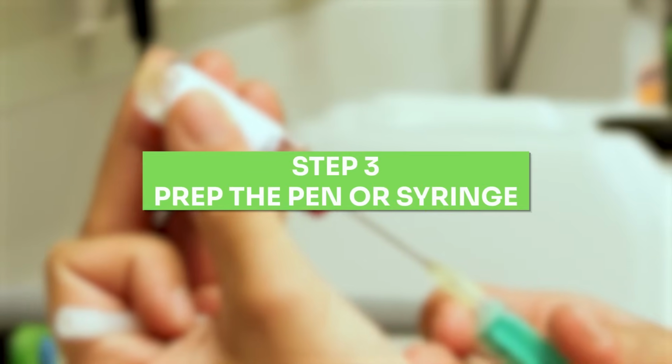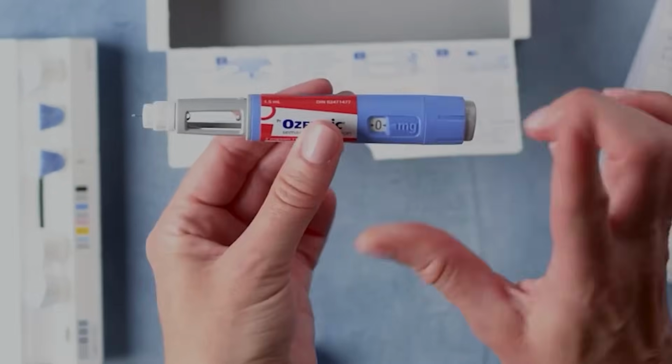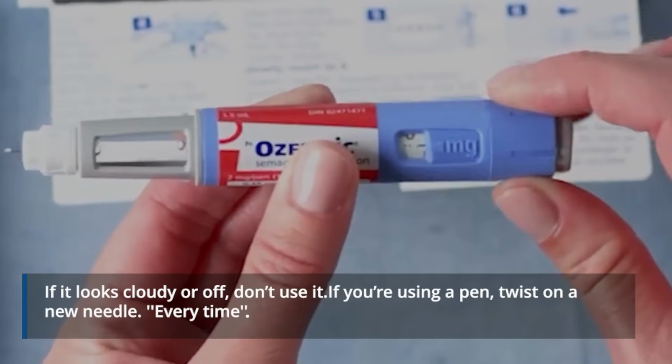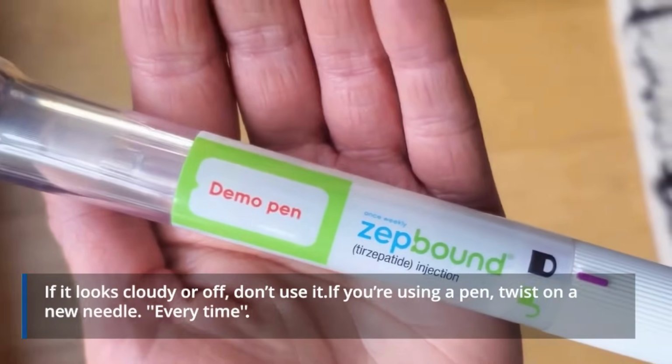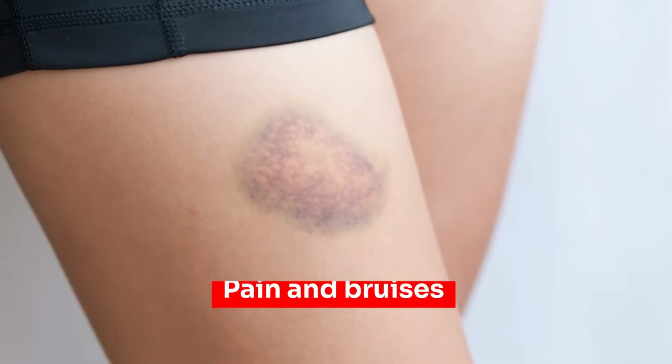Step 3. Prep the pen or syringe. Check the medication. No weird clumps, no discoloration. If it looks cloudy or off, don't use it. If you're using a pen, twist on a new needle every time. Dull needles cause pain and bruises.